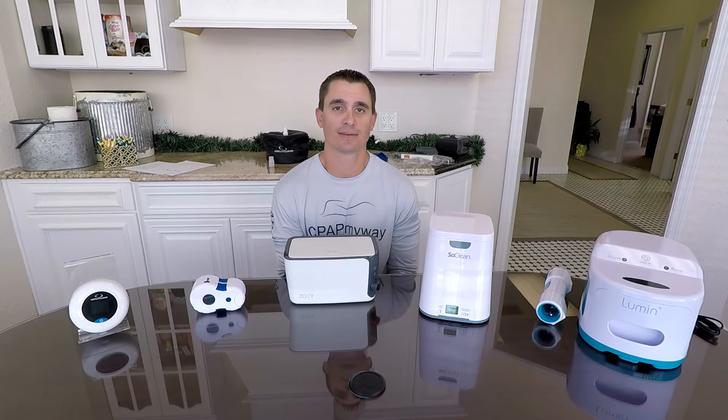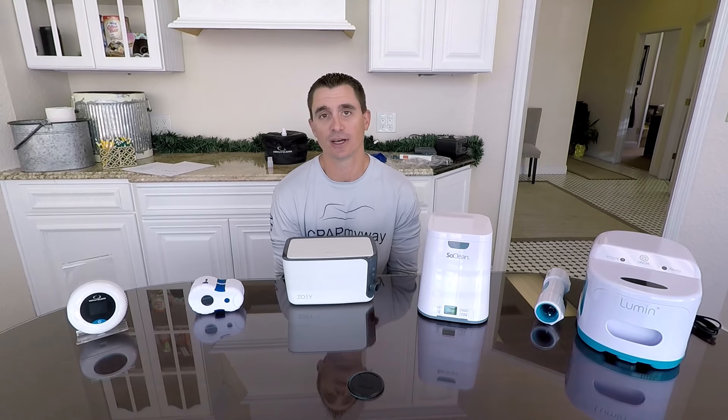Hey, I'm Clay with CPAP MyWay and CPAPMyWay.com. Today we want to bring you the top five CPAP cleaners of 2020.